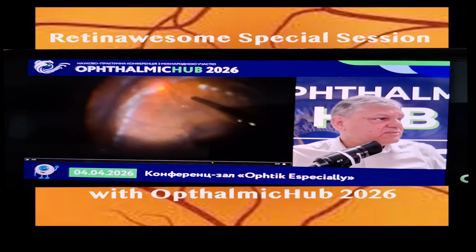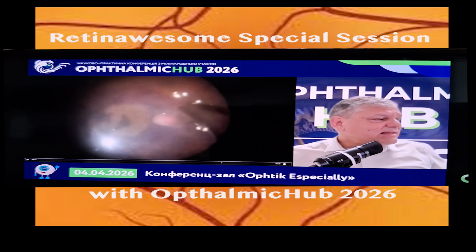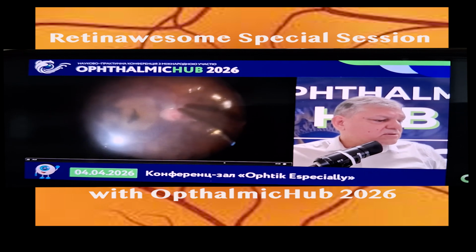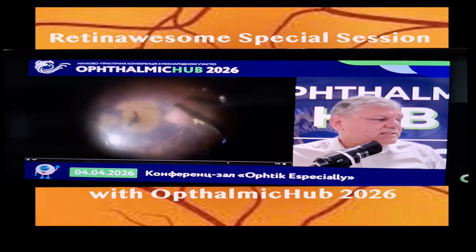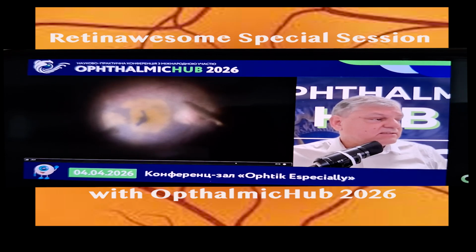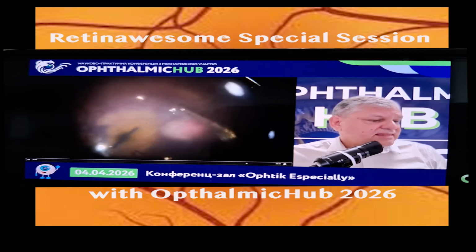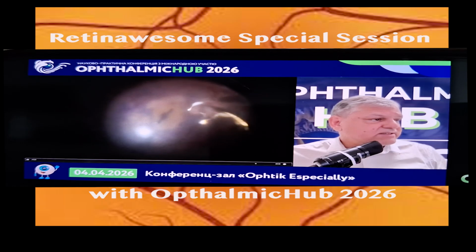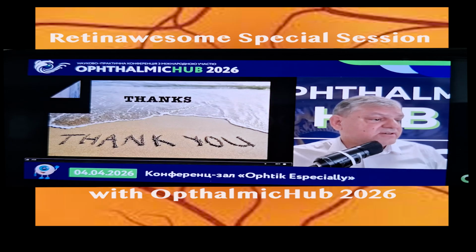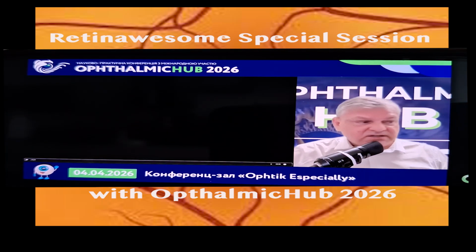As you see here, now with more fluorocarbon liquid and more endo laser, I curb the situation and there is no slippage at the retina. It's completely attached, and now very slowly I'm going to proceed with another air fluid exchange. You've got here inside the eye a pressure of approximately 15 millimeters of mercury. So it's very slow. I don't want to dislodge the seal, the internal limiting membrane that is tamponading the hole there.